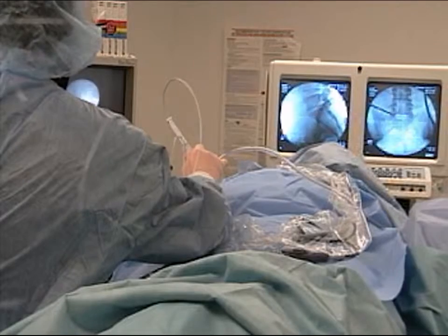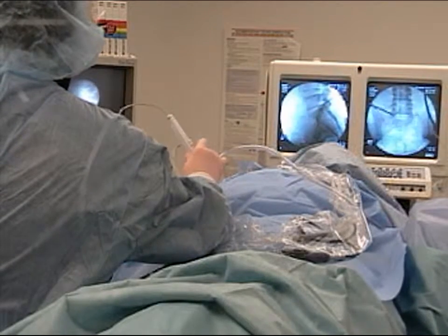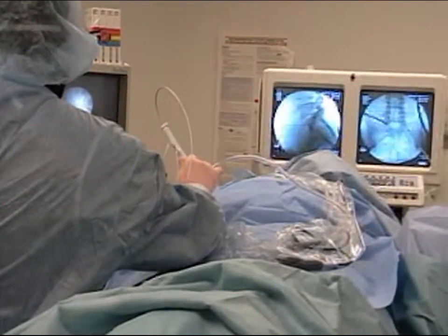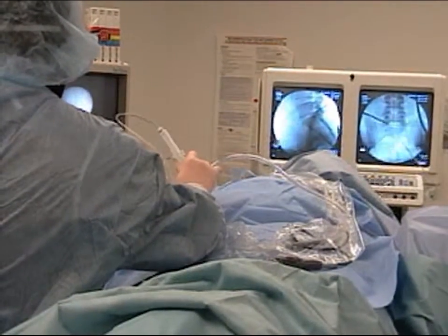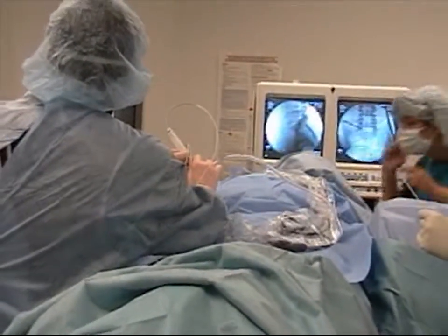The long-term success rate is approximately 85%. Compared to open surgery on contained discs, LASE offers a higher success rate and neither damages the posterior spinal elements nor jeopardizes the opportunity for subsequent spinal surgery.